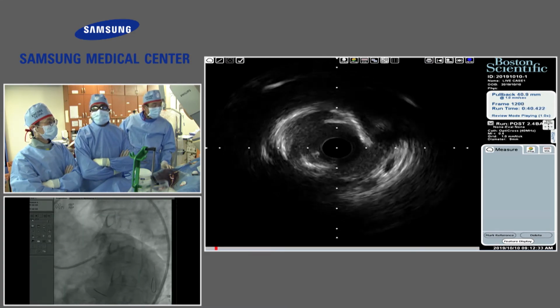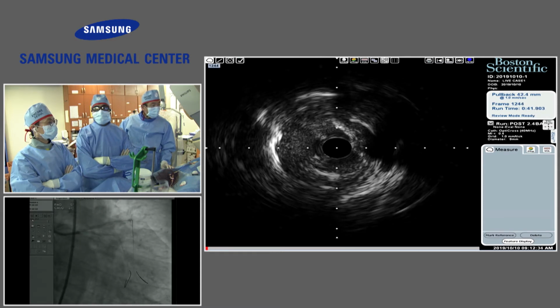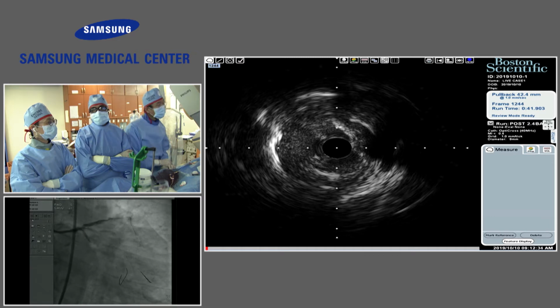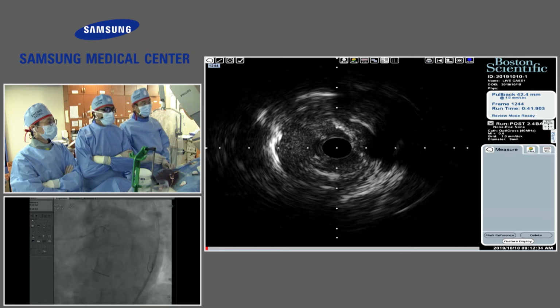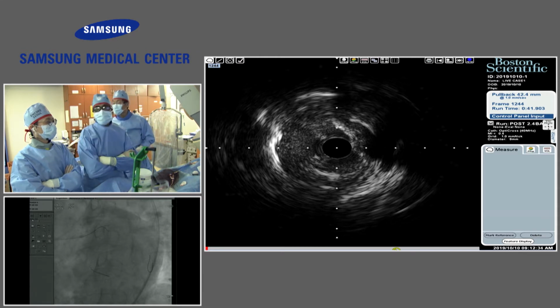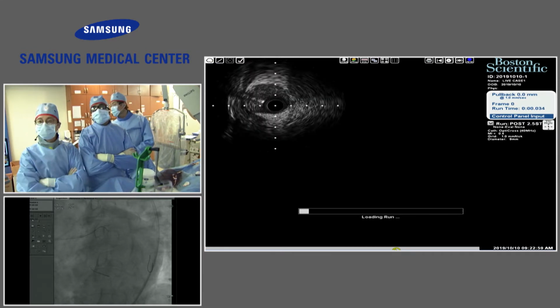Okay, so that's the proximal vessel. Okay, next IVUS, please. Next IVUS, please. Thank you. Show us the last moment.